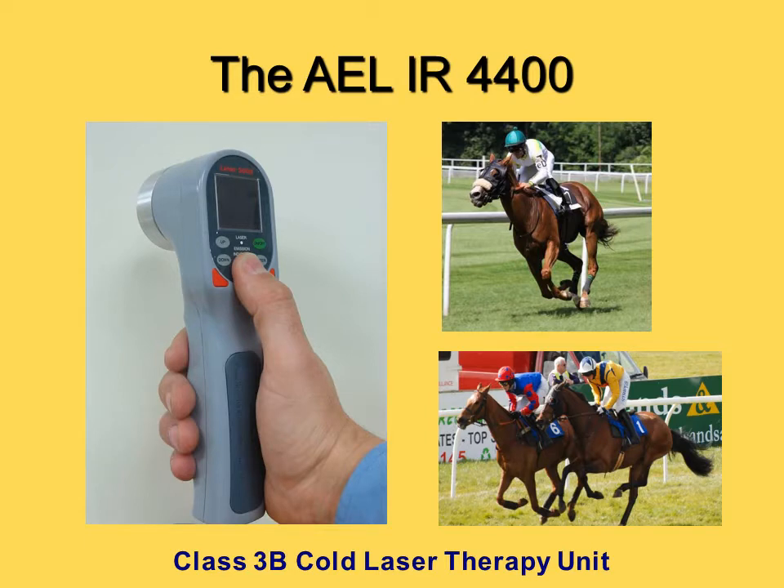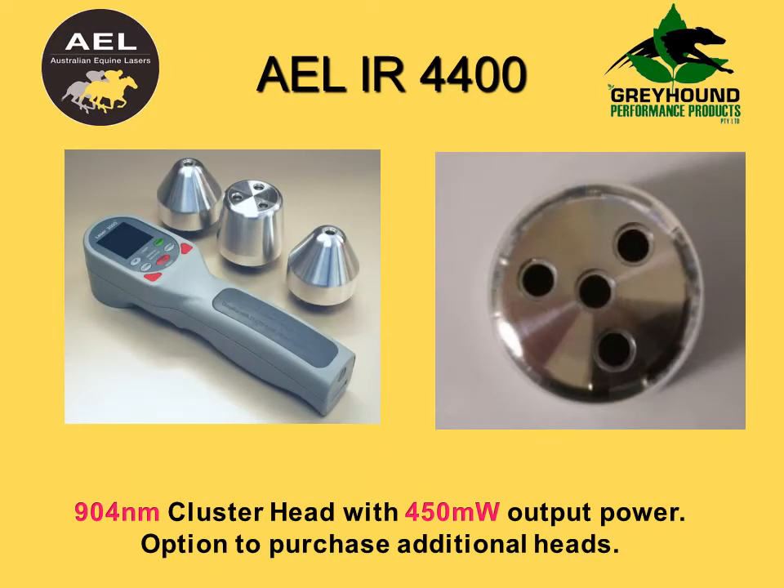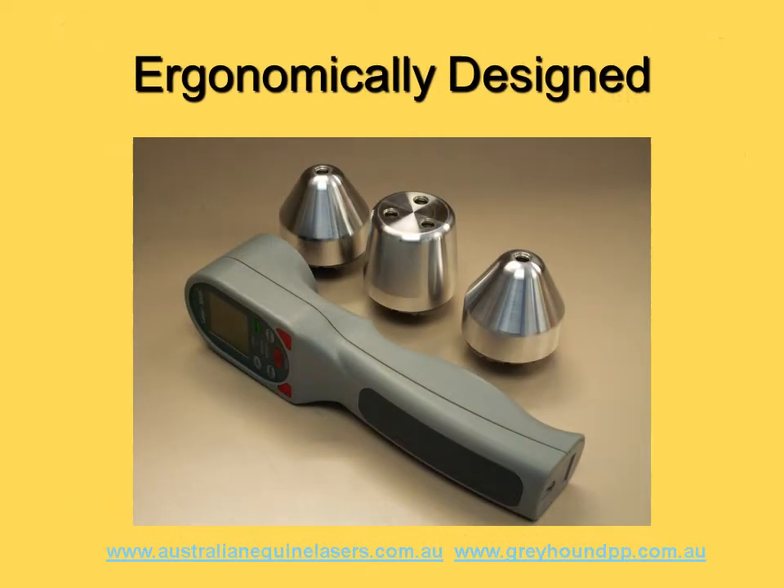Are you an owner, trainer, or vet? Are you looking for a safe, effective, painless, and drug-free way to treat horse injuries? If so, the AEL IR4400 is the product for you. The AEL IR4400 was designed so that anyone can use the product without any formal training.